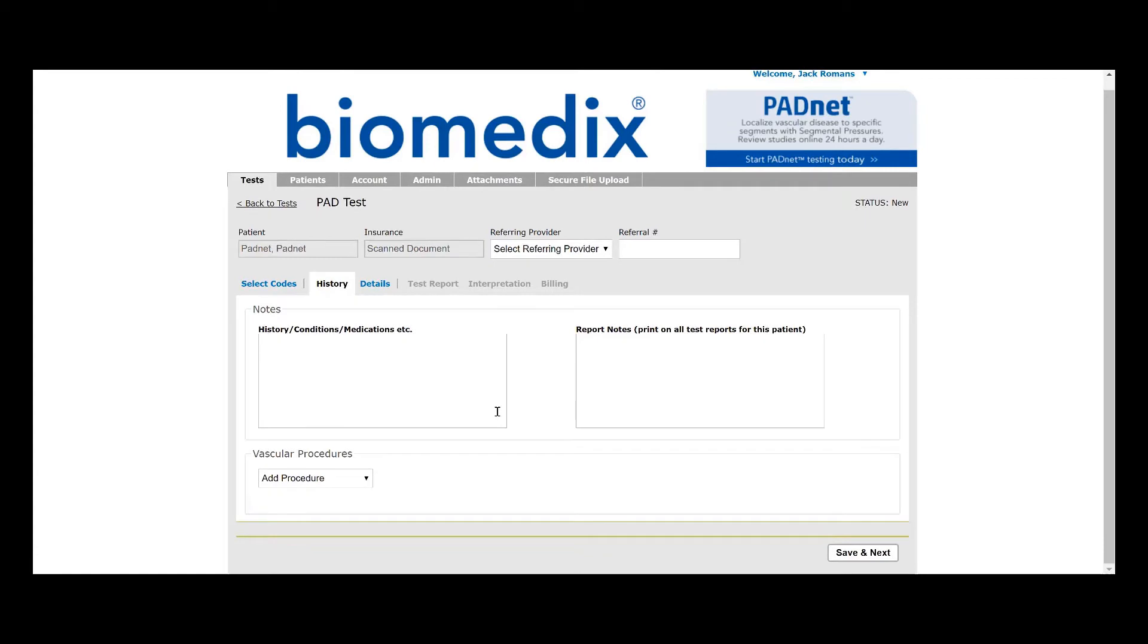Our History, Conditions, Medications, etc. box, our Report Notes box, and our Vascular Procedure section are all the same as before.